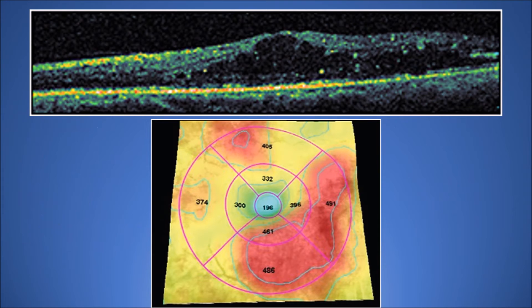Here is an example of OCT for a patient with diabetic macular edema. The upper image shows a cross-sectional OCT of thickened macula with intraretinal cysts and intact vitreo-macular interface. The second image is an OCT map, which shows the location of the edematous tissue and its thickness.